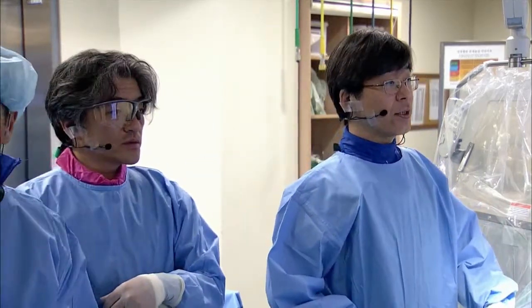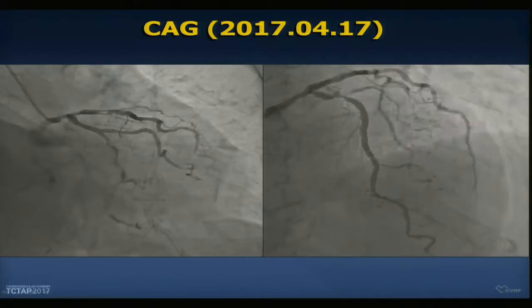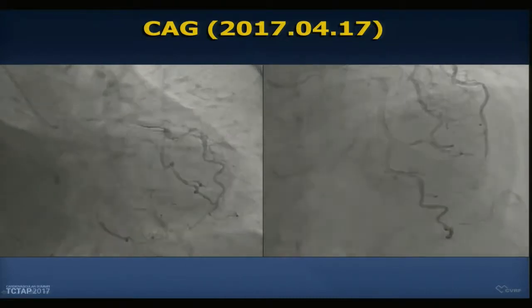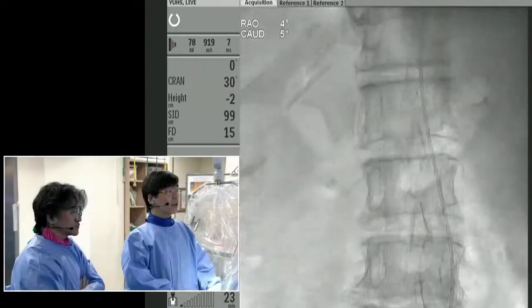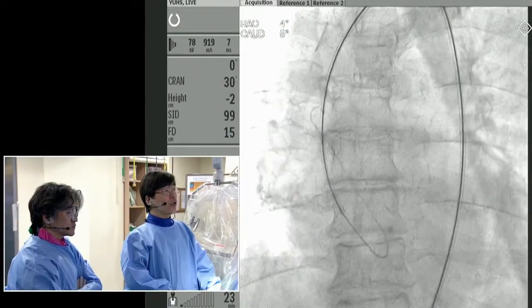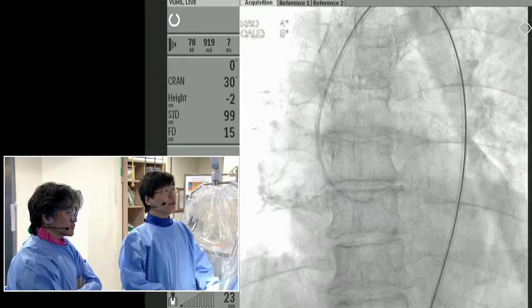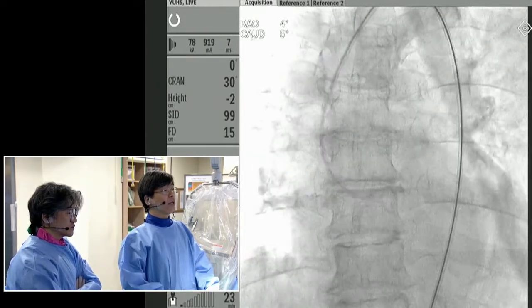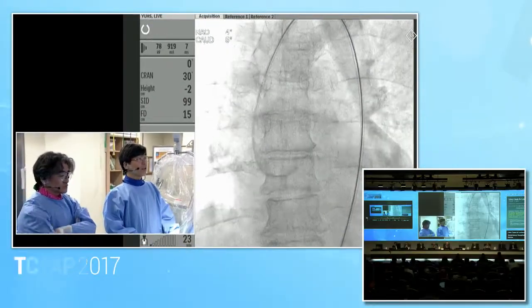Yeah, actually, this patient is an elderly patient. There is some possibility of peripheral artery disease. Next, you see there is some device in the patient's back, and we advance that, the diagnostic right side diagnostic catheter, and next. And exchange a steel wire, and then using this, the guide for the left side. What's the size? 6 or 7 French. 7 French, right side. Next.